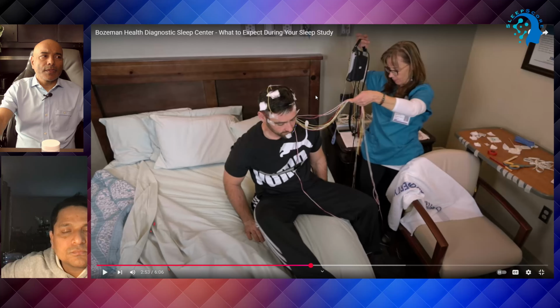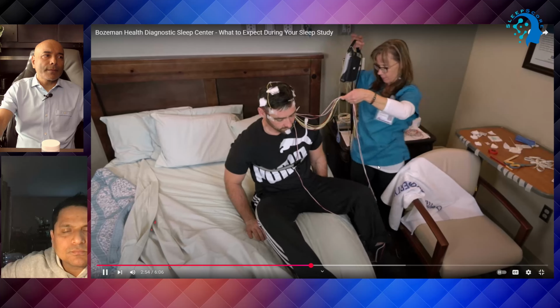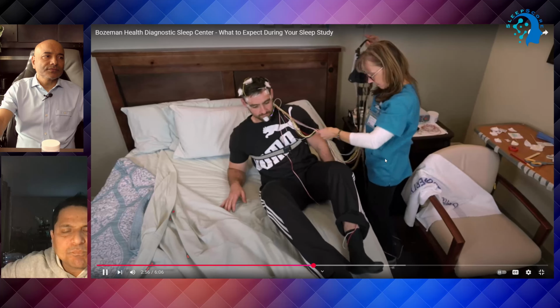Now you can see the full head hookup right here. Chin, eyes. This is F3, F4, and C4. This is C3. This side is C4, C3, F3, C4. Sorry, F3 and C3 give us a better picture of your sleep.